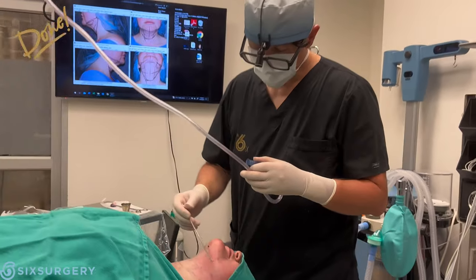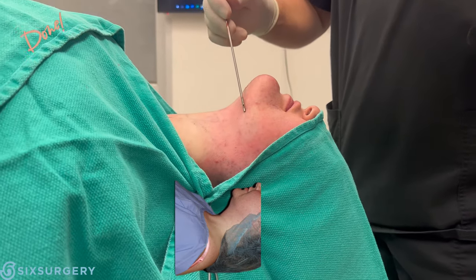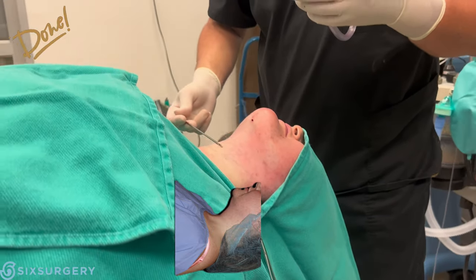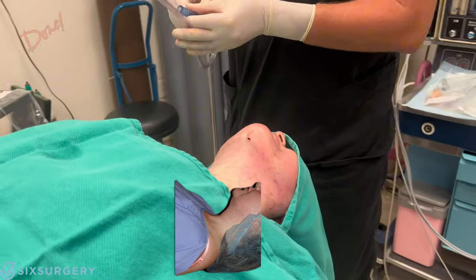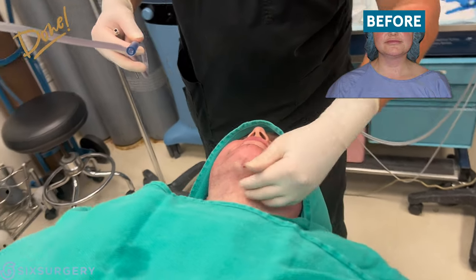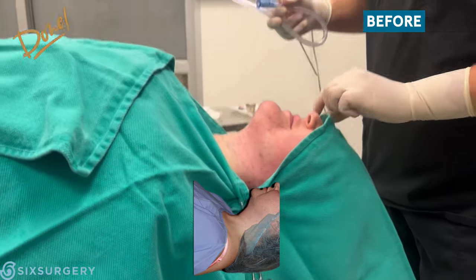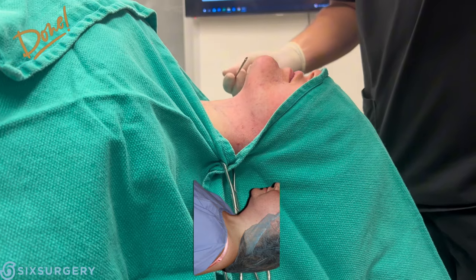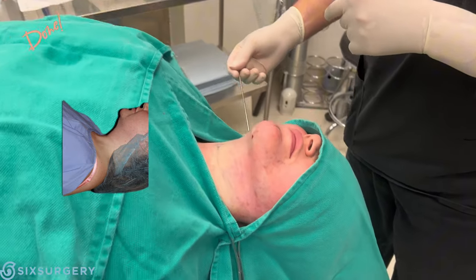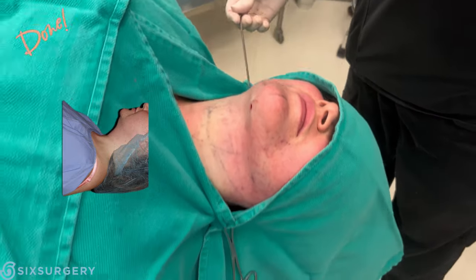Alright, we are done. You can see the shadow here — this is her jawline right here, her mandible right there. We scooped out along here. Just lift your head up a little so people can see what this looks like from the side. You can see the contour right there — all of this was liposuctioned out.